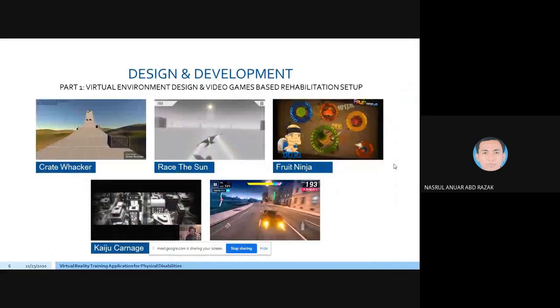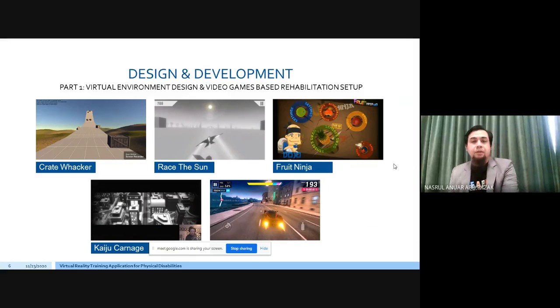Okay, so like I said before, after we finished with the conventional way of training with the box and block tests, we also developed some commercial games that can be used with this virtual rehabilitation technique. Using these different games might bring motivation and improve the current situation of how prosthetic and orthotic users are motivated to use the technique, etc.